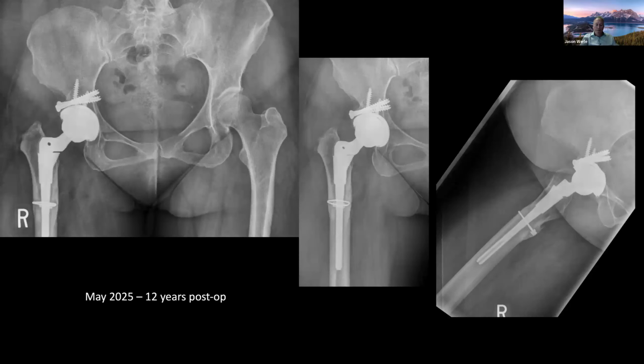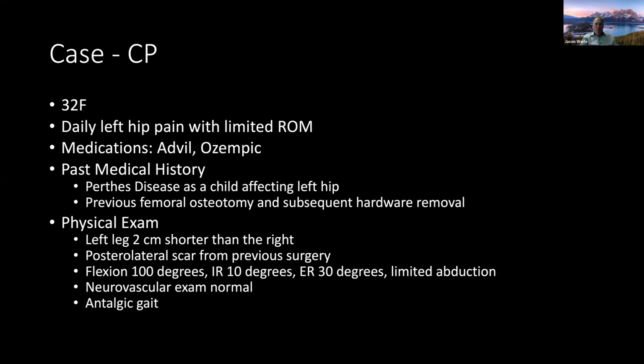There's one more case. Here's some follow-up just 12 years later. So last May, you can see how, obviously, the osteotomy is united and she's got good long-term performance of this bearing so far. There's one more case we'll just kind of race through because we're down to the last minute or less.